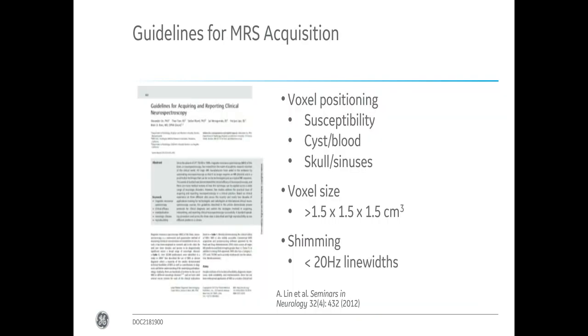So there are guidelines for these MRS acquisitions, especially for these focal diseases, and I suggest you look at the paper from Alex Lin.